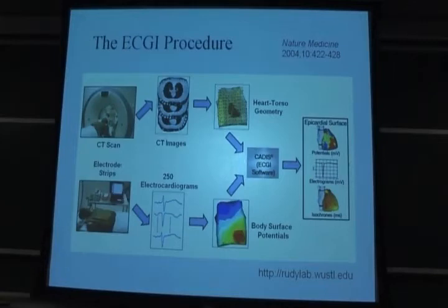And then, if you sample each electrocardiogram at one instant of time, and you go through all of them, you get the potential distribution at that instant of time over the entire torso for this particular patient. And you do this every millisecond throughout the cardiac cycle. So you have many of those maps, and that constitutes your non-invasive electrophysiological or electrical data set.